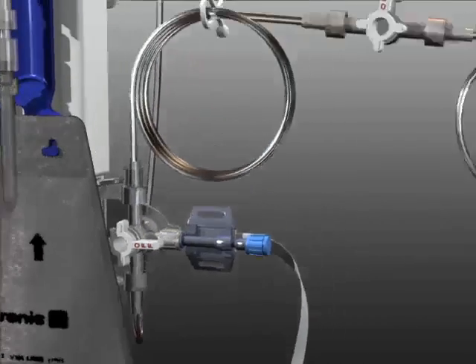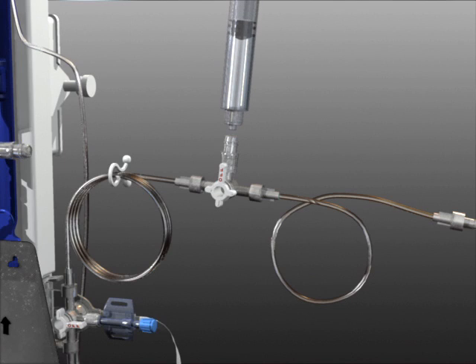To prime the system, fill a 30 cc or larger syringe with preservative-free normal sterile saline. Using sterile technique, attach the syringe to the patient line stopcock injection site.